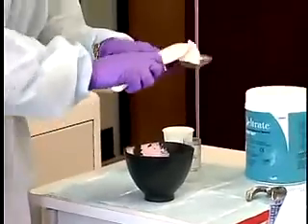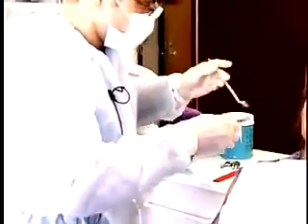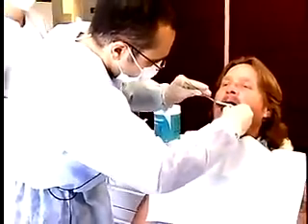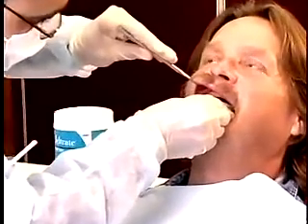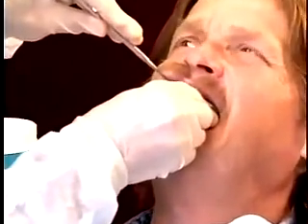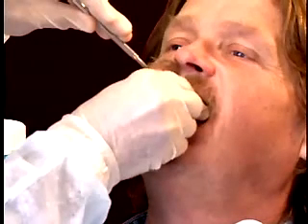Then load it into the stock tray. Stand in front of the patient and place the tray at the left corner of the mouth. Reflect the right corner of the mouth with a mouth mirror. Seat the loaded tray posteriorly first, then push slowly to the front so that the alginate flows anteriorly.